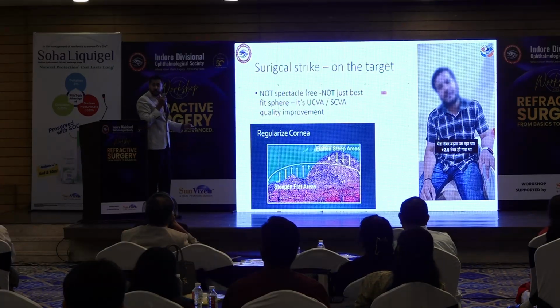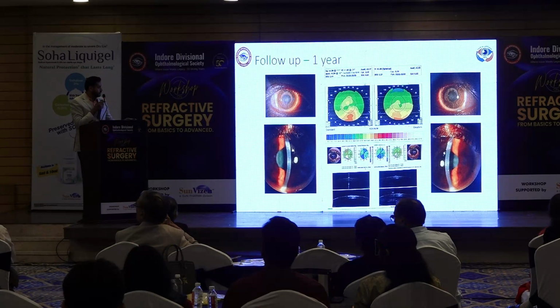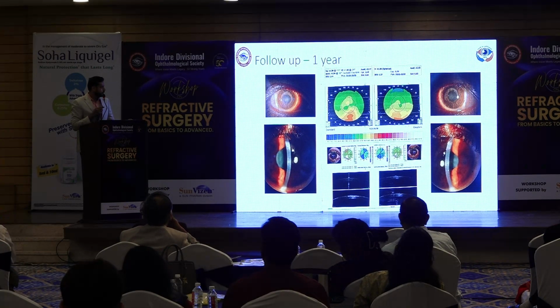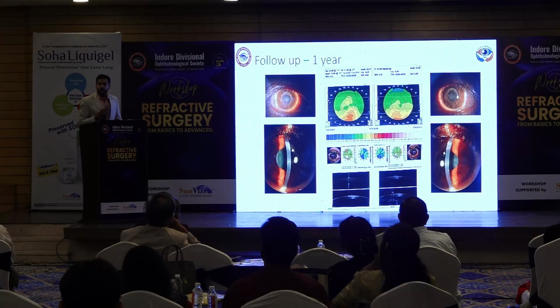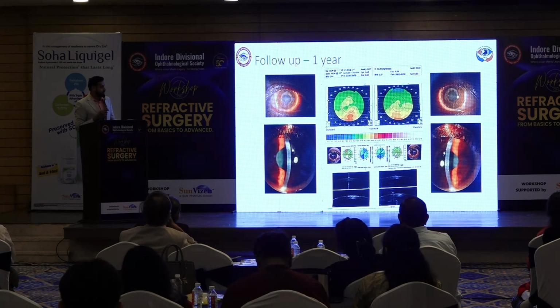But if you go back to your case, if you do the differential mitomycin, you will avoid that crescent-shaped scarring, because your cornea is an inferiorly decentered cone. So you have burned to make the cornea more regular in shape. It has burned close to 70 to 75 microns on the top. Yes, because the more the decentration, the more the burn on the opposite side.